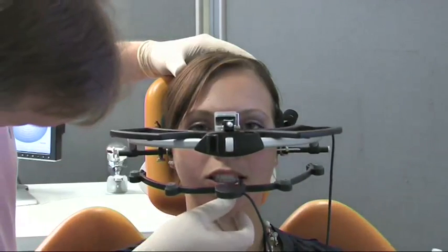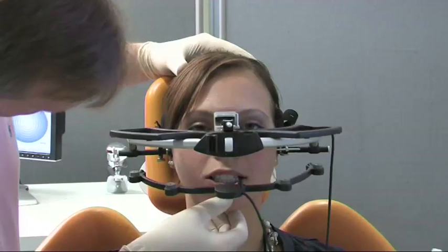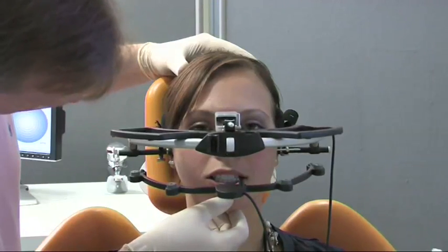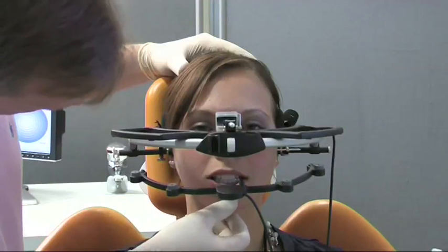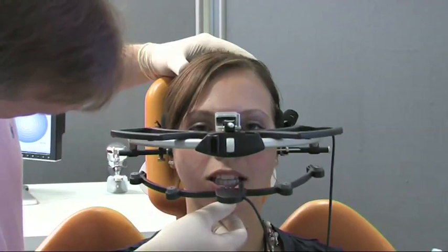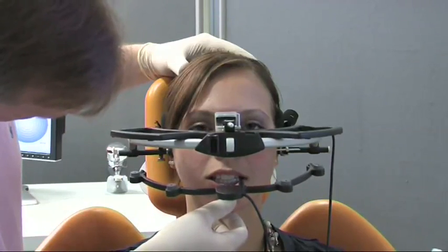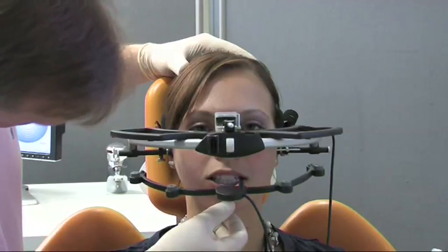Good. Now I'll not make the movements for you, but just guide your chin a little or observe what you are doing. Now please open your mouth 1 millimeter and close again 1 millimeter. Again open 1 millimeter and close. Open and close. Close a little further. Open again and close.